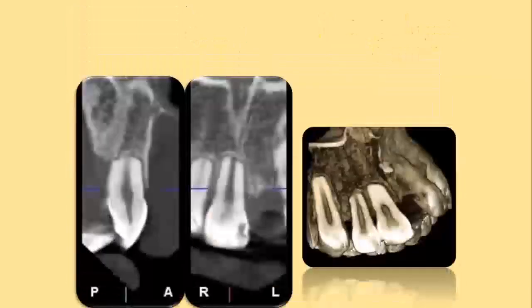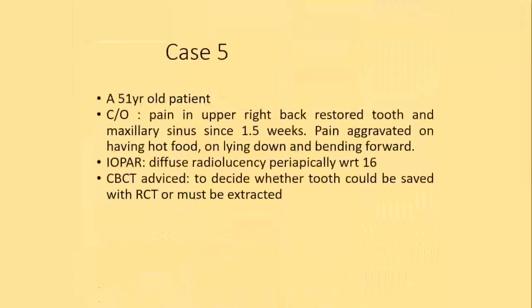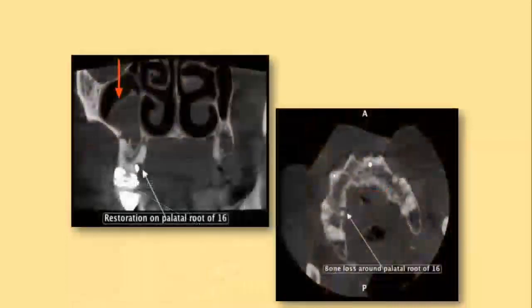Fractures, internal resorptions, external resorptions. You see a lot of resorption happening there. The apex is resorbed. You could see that on 3D reconstruction. Great. I have a lot of case reports I want to discuss, but just this maybe.